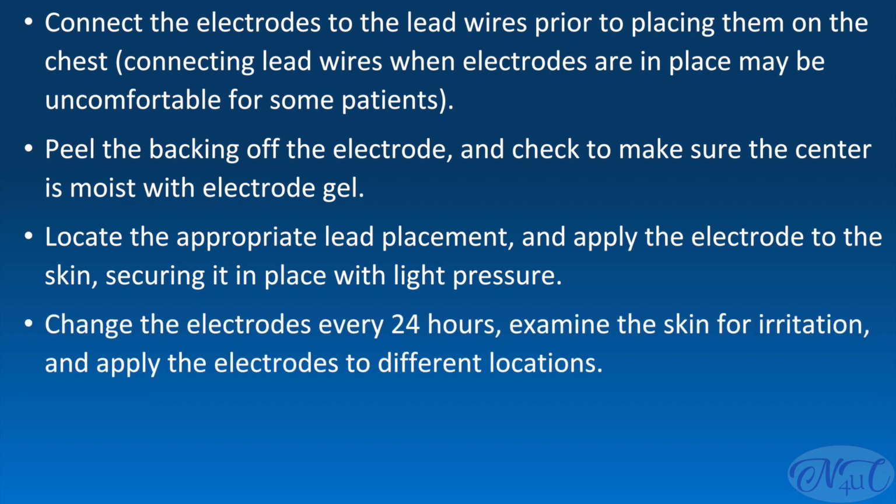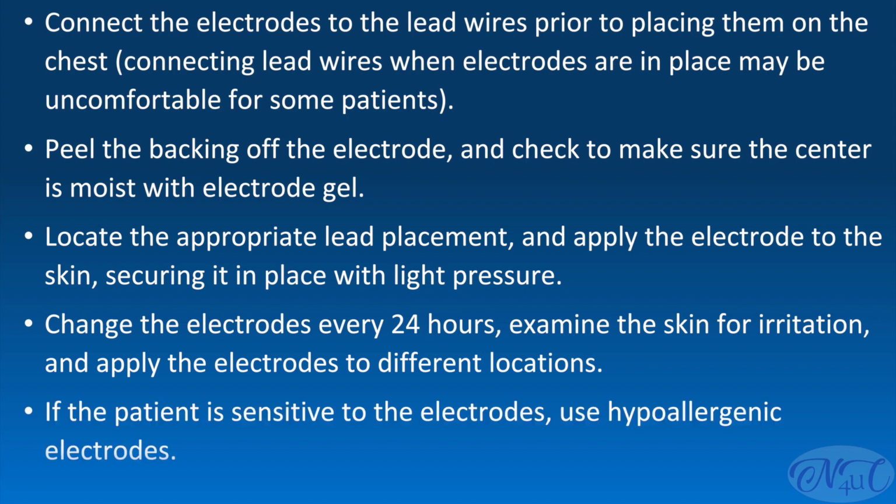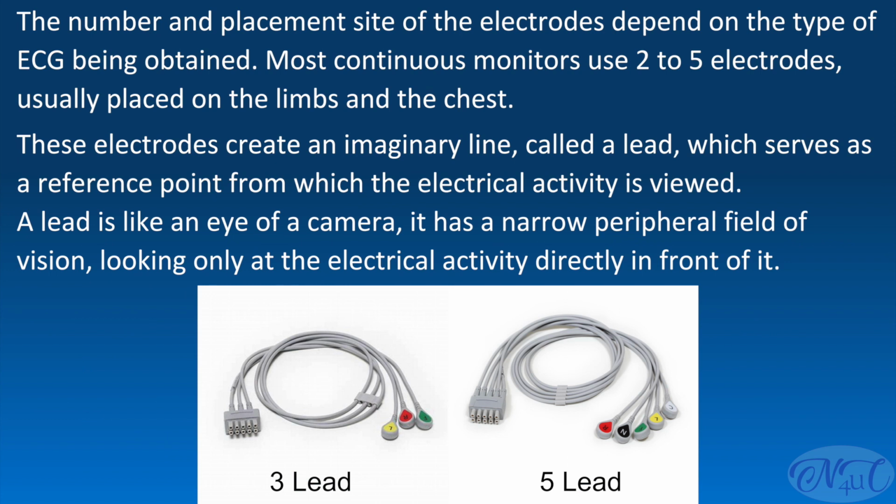Change the electrodes every 24 hours. Examine the skin for irritation and apply the electrodes to different locations. If the patient is sensitive to the electrodes, use hypoallergenic electrodes. The number and placement site of the electrodes depend on the type of ECG being obtained.